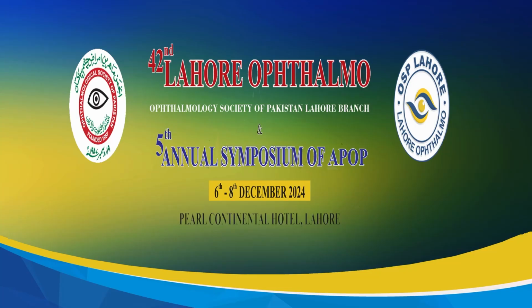Mind you, there is an incidence of retinal detachment following YAG capsulotomy, and we can see a lot of reports about this. Besides pitting the lens, and if you put a multifocal lens, this distorts the quality of vision very much.